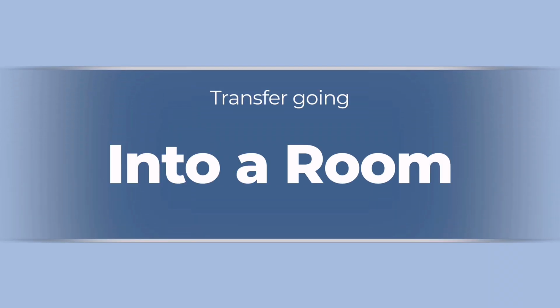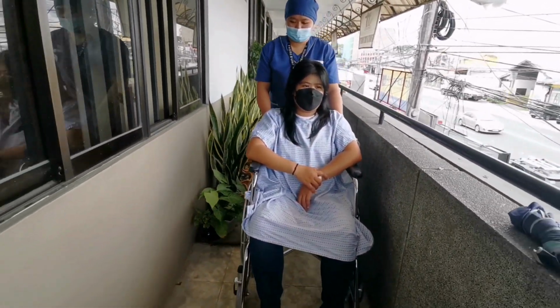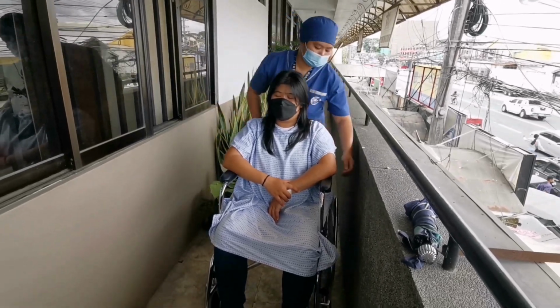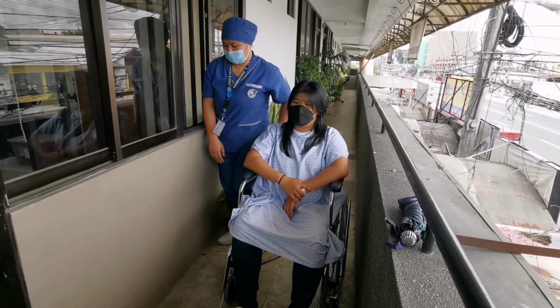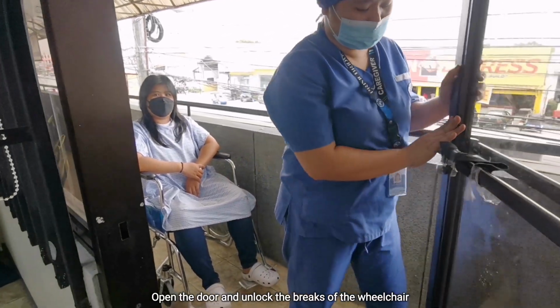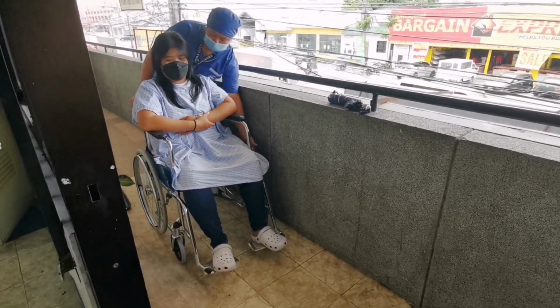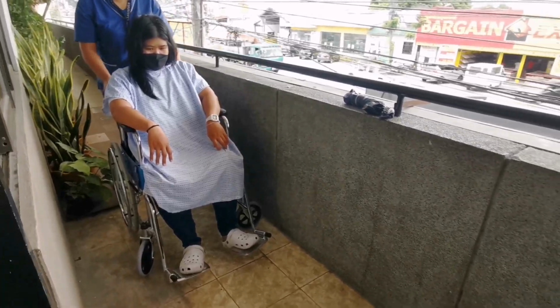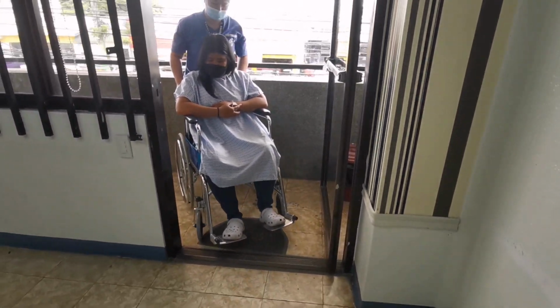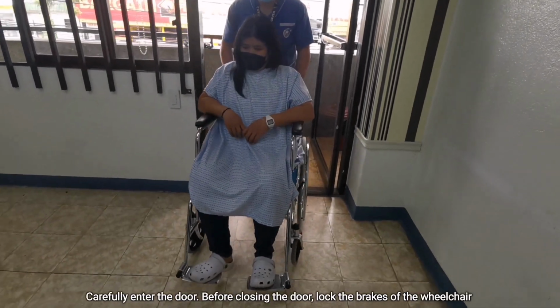Transfer going into a room. Before approaching the room's door, make sure to lock the brakes of the wheelchair first. Open the door and unlock the brakes of the wheelchair. Carefully enter the door. Before closing the door, lock the brakes of the wheelchair.